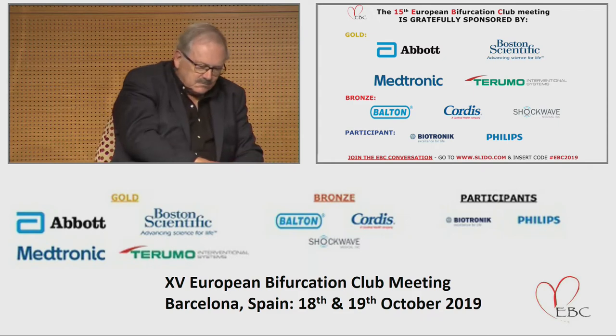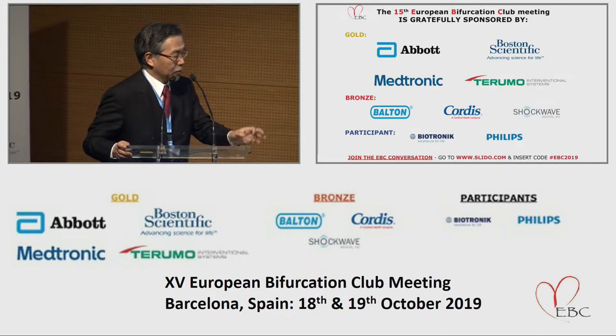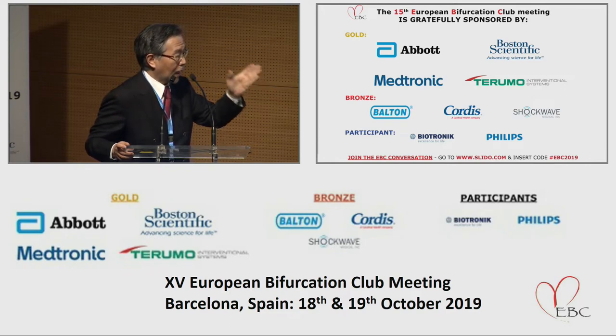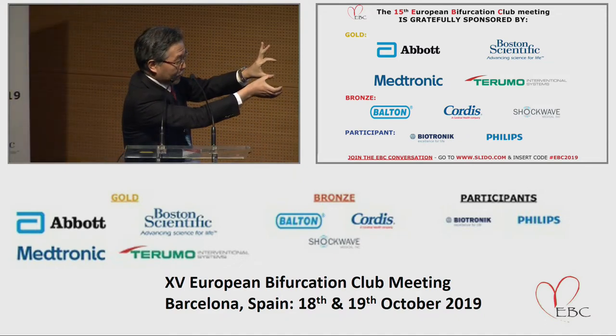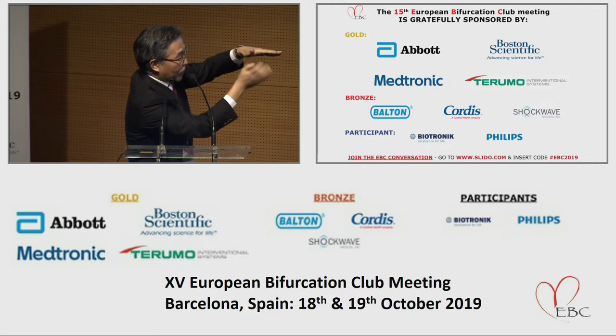In Illumin 4, they have taken 90% expansion, and that is calculated at the MSA. Now, in this new software that you showed, how is the expansion index different from the MSA? The expansion index is calculated by the newly set reference diameter. The reference diameter should be set at the branching point, distal side, where the side branch enters. So according to the Fukuoka model, the new reference diameter is set at the distal side of the branching point.